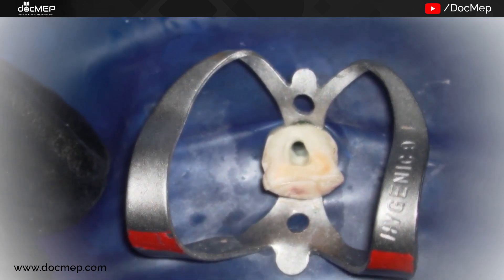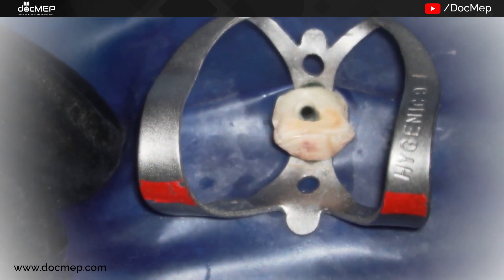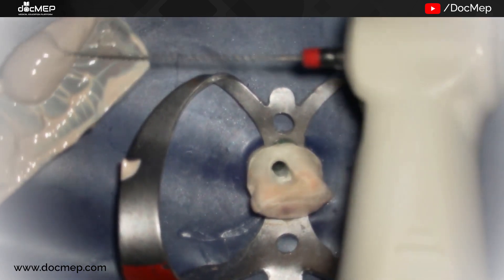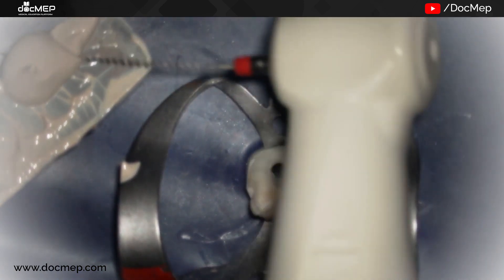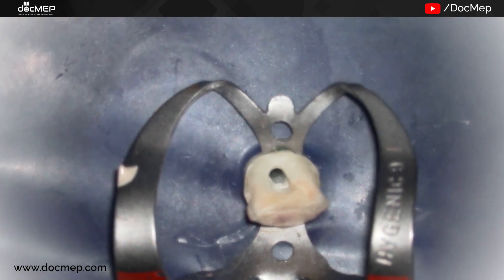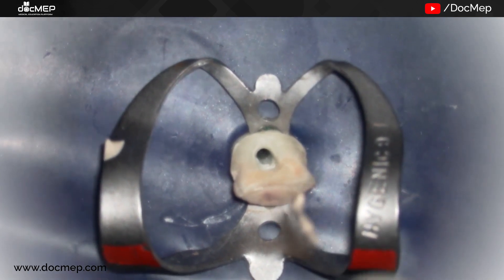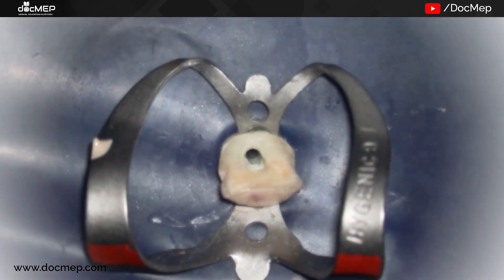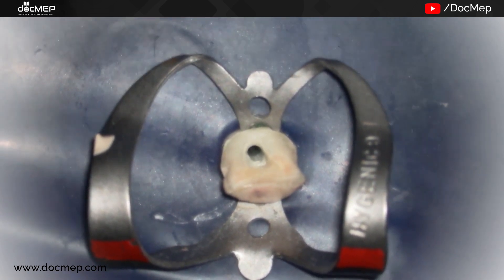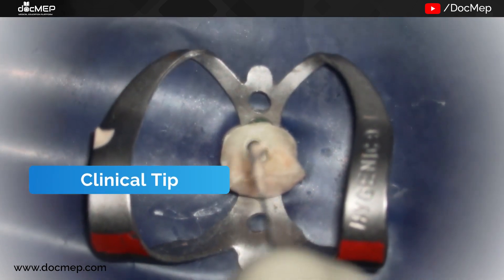Once the canal is clean and dry, it is ready for sealer placement. Sealer is placed in the tooth using a lentulo spiral — that is my preferred way. You can see the consistency of the sealer: a rich, creamy paste. Anything more viscous or more fluid will not flow properly, so we need to have the right consistency of sealer.